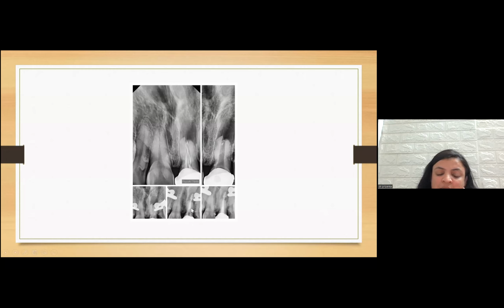And then on the fourth or fifth sitting, we again cleaned, disinfected, and I filled it up entirely with MTA because of this defect over there. By chance, if it gets communicated with the canal, then also I think it should serve for at least a few years.